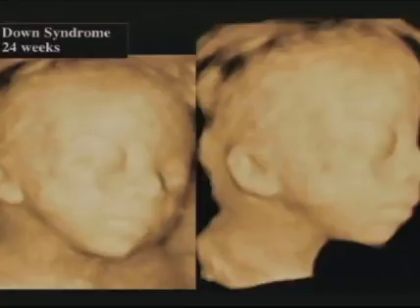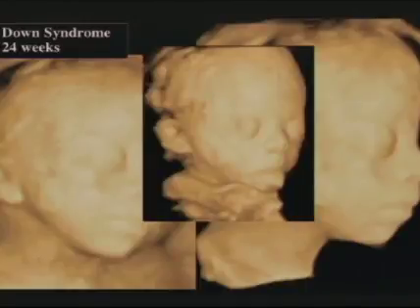And now we have that capability because we're able to render the face and look at the dysmorphology that the geneticists do after birth. Here is this fetus with Down syndrome showing the protruding tongue because fetuses with Down syndrome have poor tone and the tongue tends to protrude.